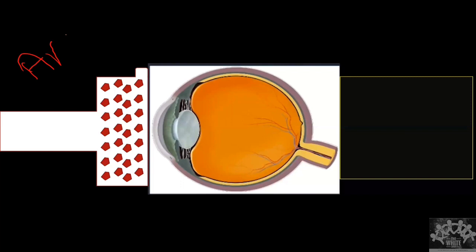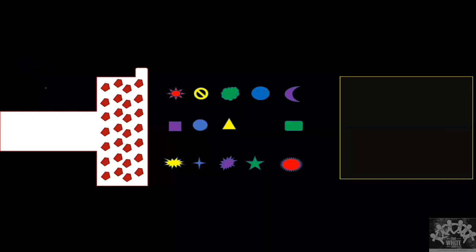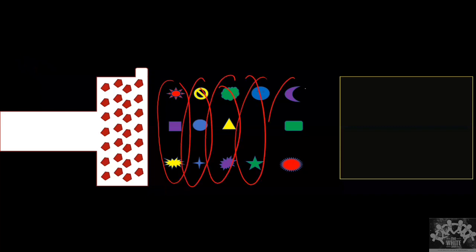Now, this is used only in ophthalmology. Sometimes they use it, but now also the use has reduced. We in radiology don't use the amplitude scan. Now, how does amplitude scan work? Imagine there is an orbit. An orbit is made up of various tissues. You just think that multiple tissues are present at different levels of the orbit.